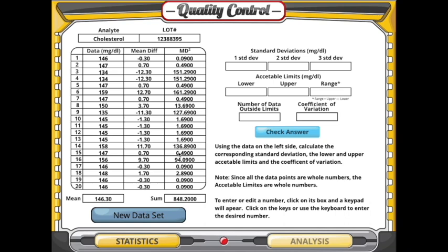Calculate the standard deviation for the samples and enter the results on the right-hand side of the screen. Also, enter the values for 2 and 3 standard deviations. Calculate and enter the acceptable limits, both the upper and lower values, and the range of the dataset. Determine and enter the number of data points outside the acceptable limits and the coefficient of variance. Select the Checked Answer button to have your answer evaluated.